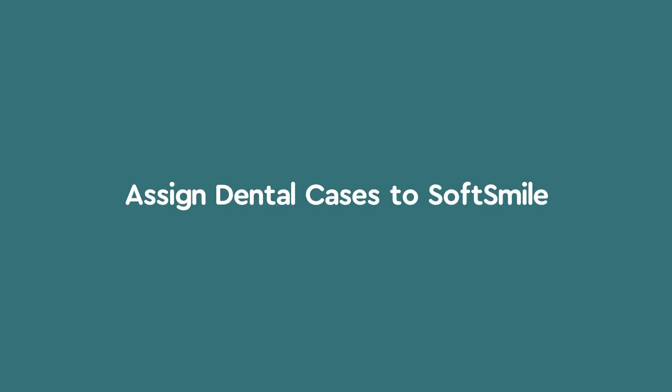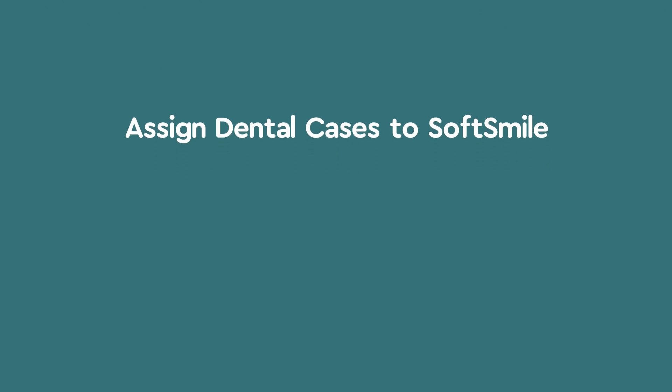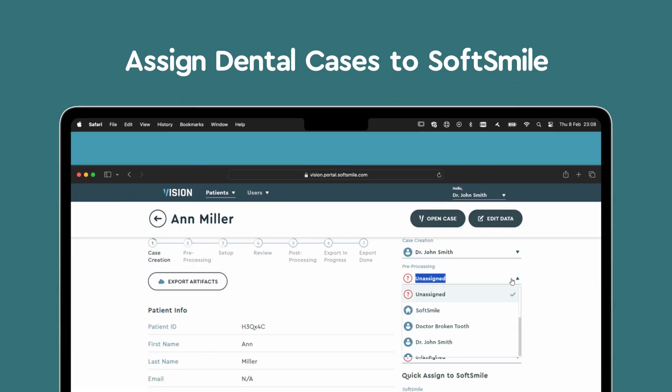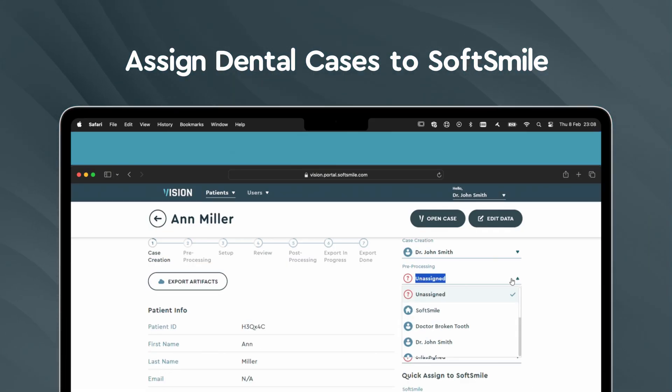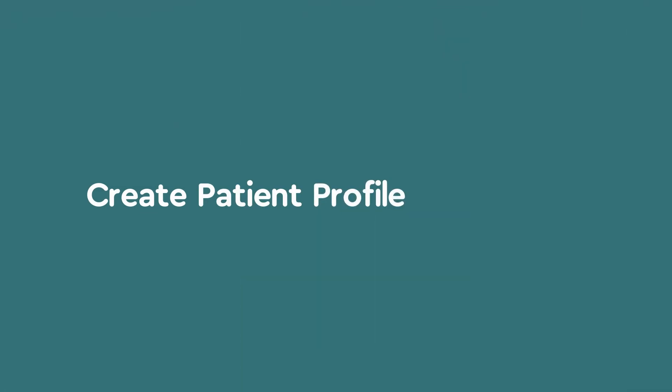Welcome to a simpler, faster way to ensure your patients receive the best dental care preparation. With just a few clicks, you can assign a case to SoftSmile, connecting your patient profiles directly to our expert team.